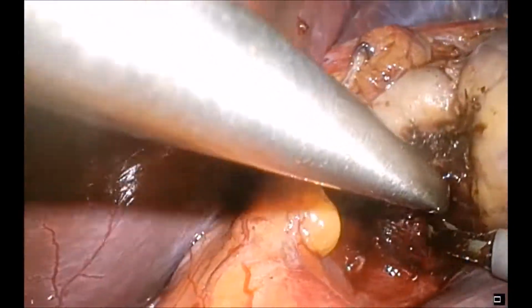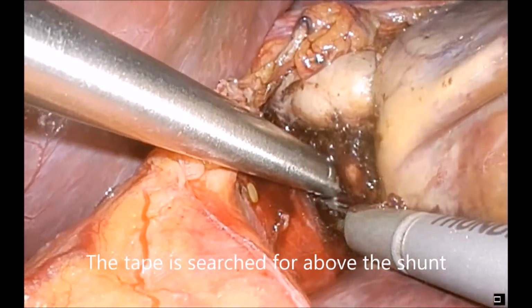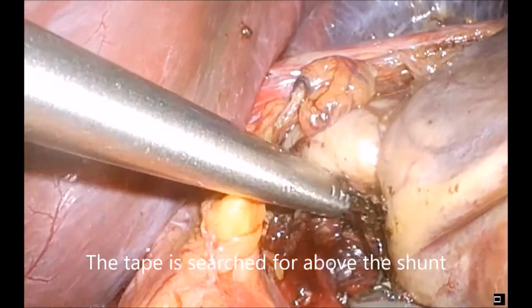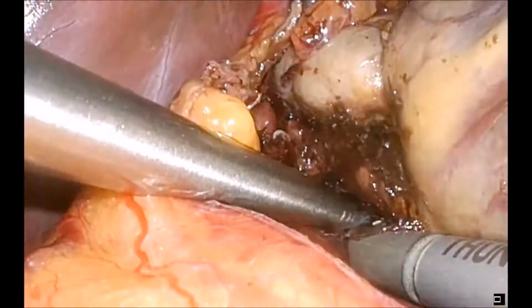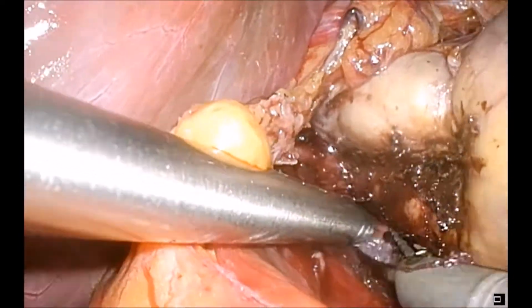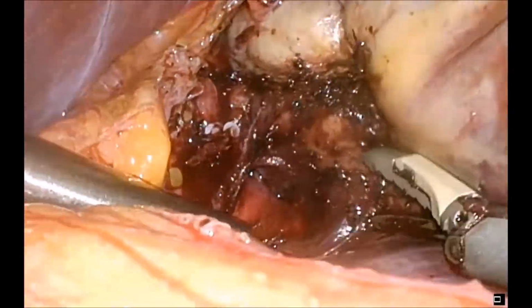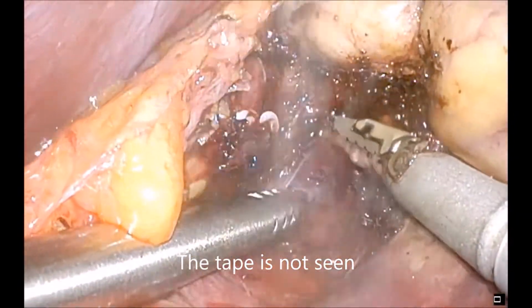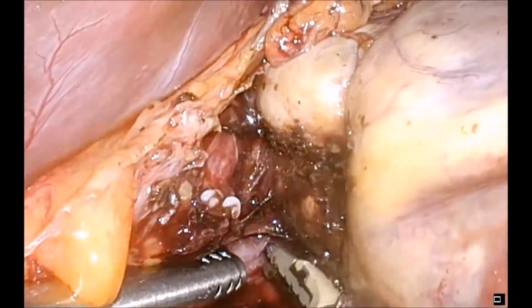Trying to get around the bridge of caudate tissue that runs over the front of the shunt down to the inferior vena cava. We passed a tape from behind in an attempt to see it from the front here, but ultimately we're not successful in that. Further dissection from the front to get down towards the vena cava.